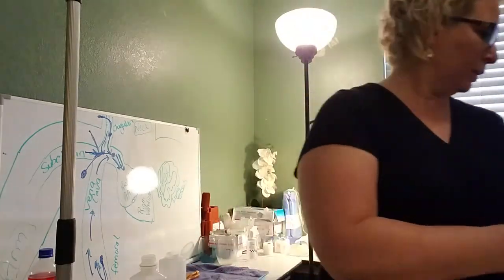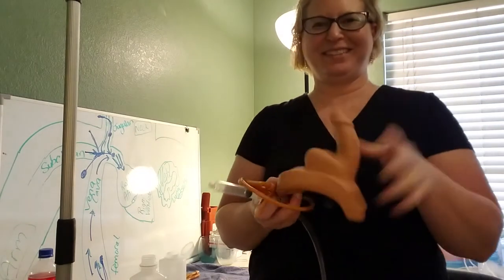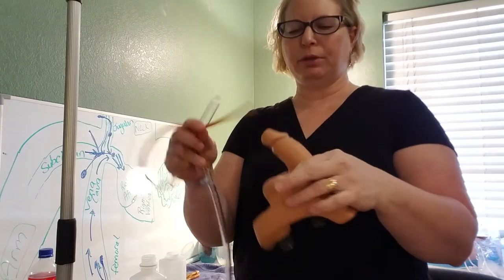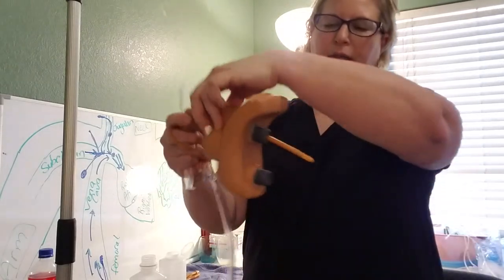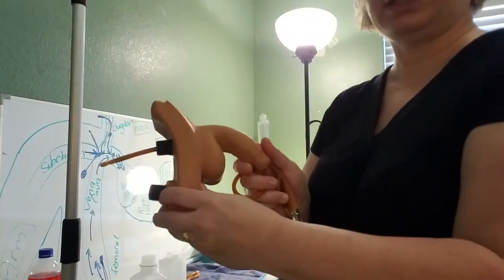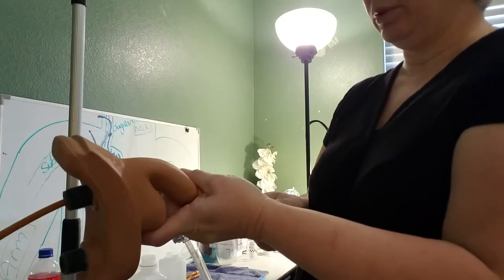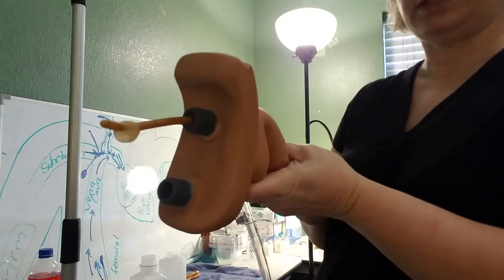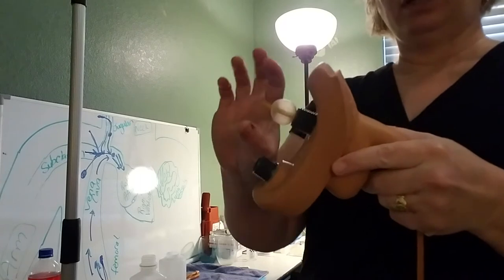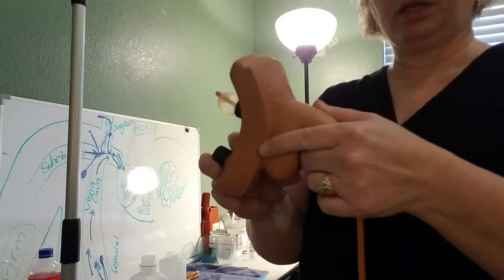Let me show you one other thing — I'm going to borrow a part from Carl here to show you repositioning the Foley. I like this part because it shows where we would insert the catheter. We're going to say that once it is past this point, it's in the bladder, and this here is going to be the prostate or the urethral sphincter. We're going to inflate this balloon with 10cc of water. What this does is it sits on the urethral sphincter, keeping fluid from flowing out of the bladder around the sphincter and keeping things from dripping out.